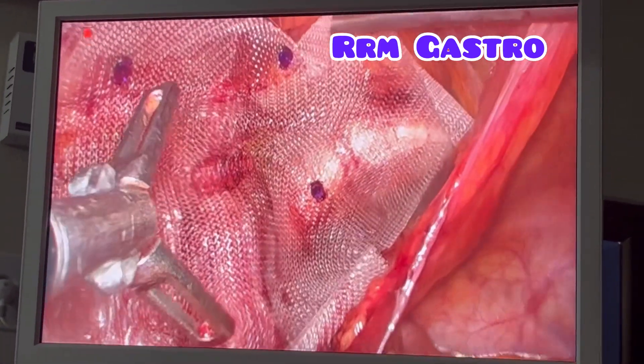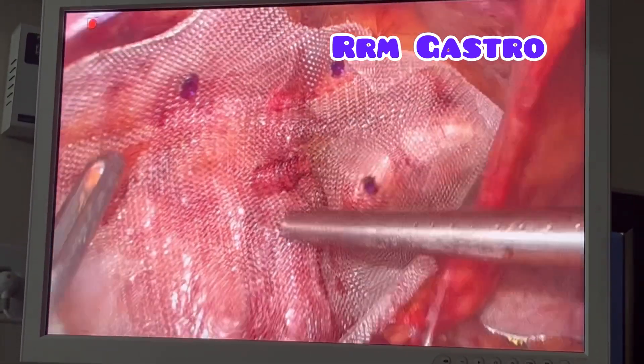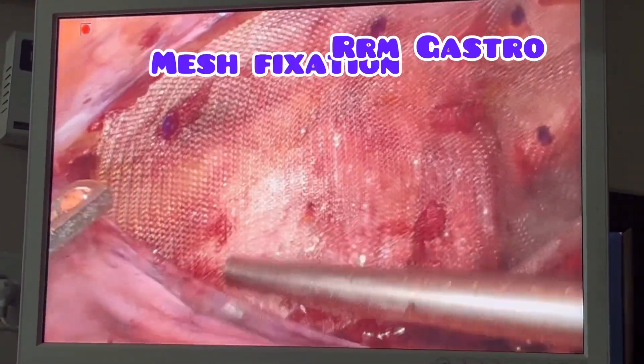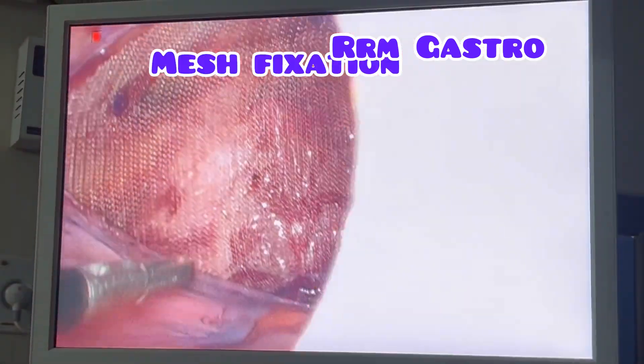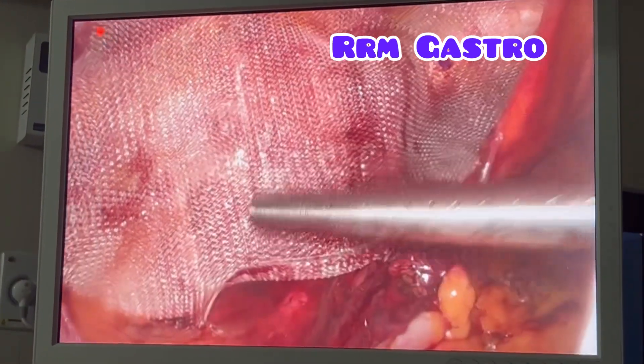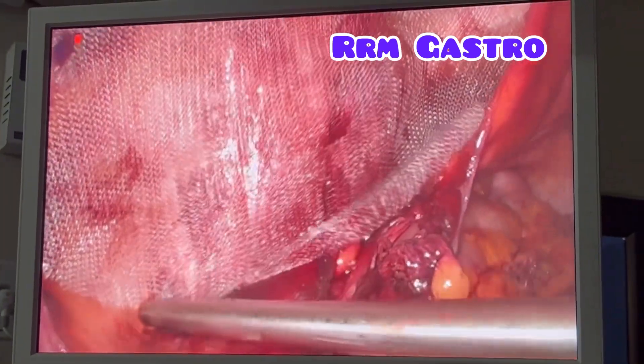You can see I have kept a 13 x 15 cm size mesh and I have fixed it with the tackers. This is a new type of tacker which has come, called a vicryl tacker. I have now dissected the entire peritoneum and kept the mesh in the pre-peritoneal space. We have to push it further down so that it will not coil up.